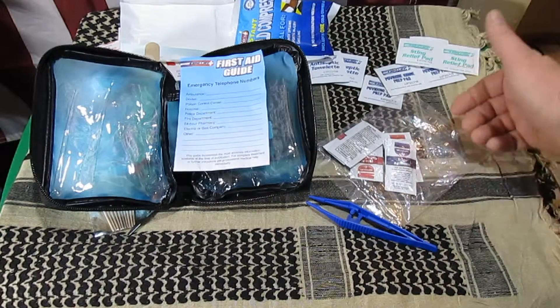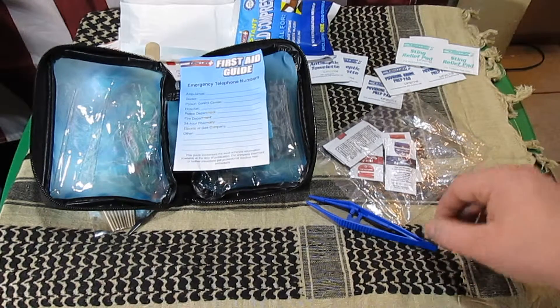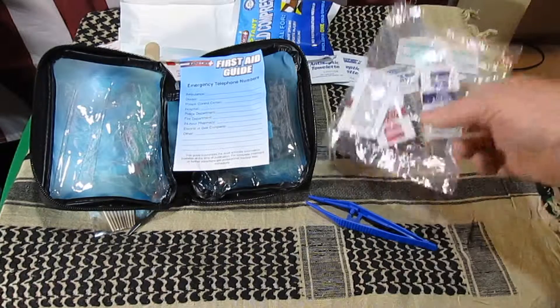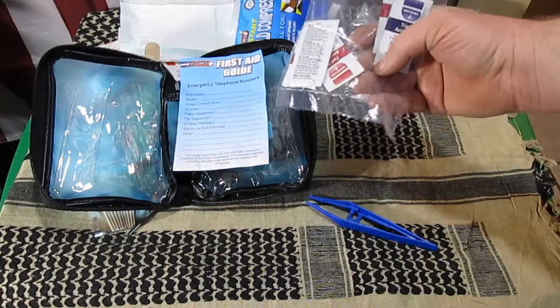It's not a bad kit — I paid $10 for it. I think they sell for about $20 on Amazon, it just depends on where you get it. I thought it was kind of odd that you only get one packet of triple antibiotic ointment and 5 packets of burn gel.